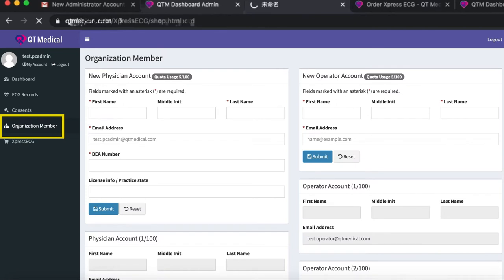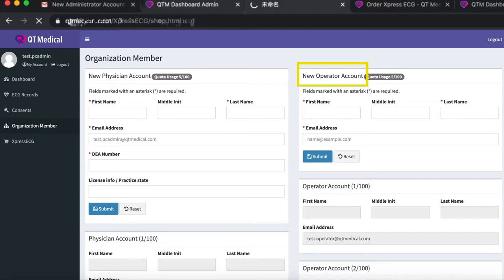You can now go to organization member in the menu to create up to 100 physician accounts and up to 100 operator accounts.